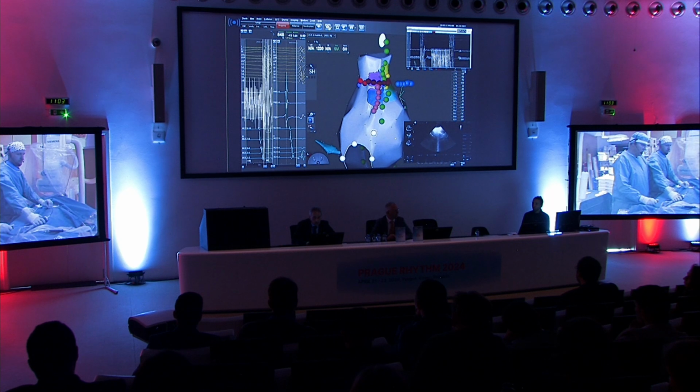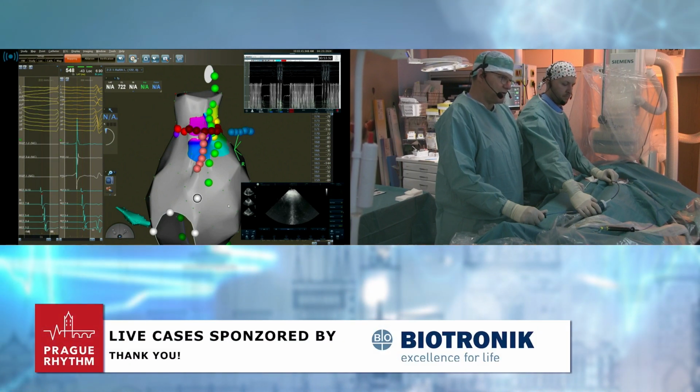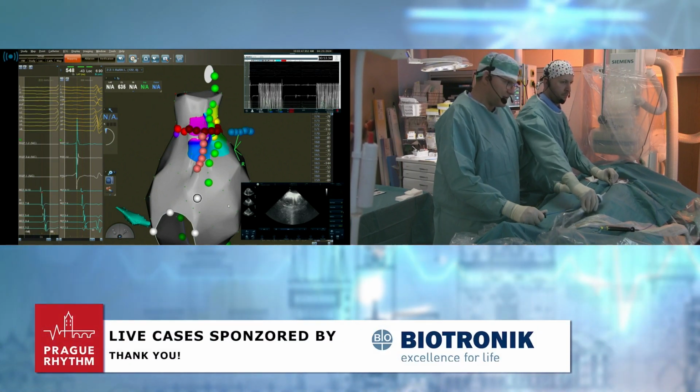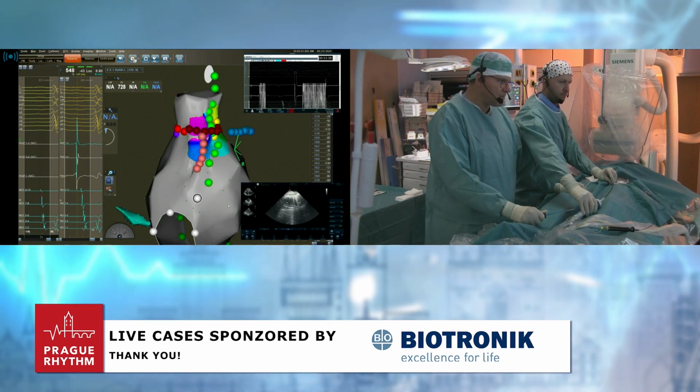Okay. Thank you. Dan, did you replace the catheter? Yeah, we replaced the catheter and cable at the same time, so we don't know if it is the cable or the catheter, probably the catheter. So we continue creating this lesion.